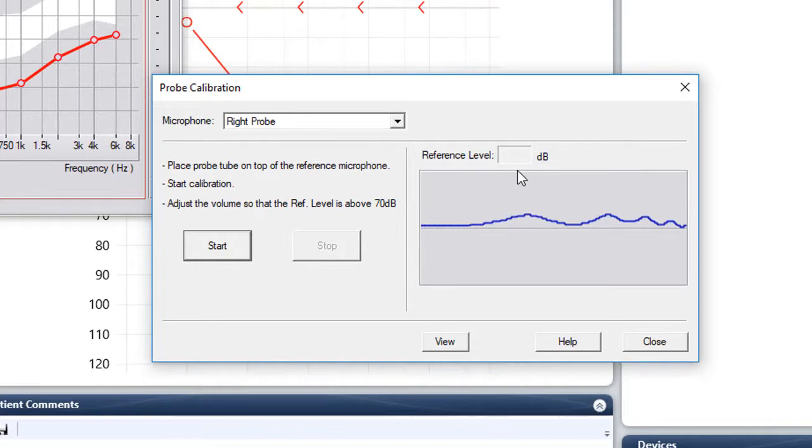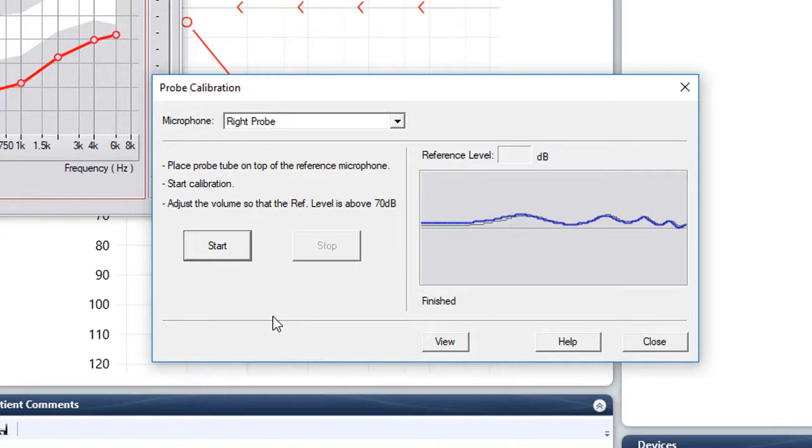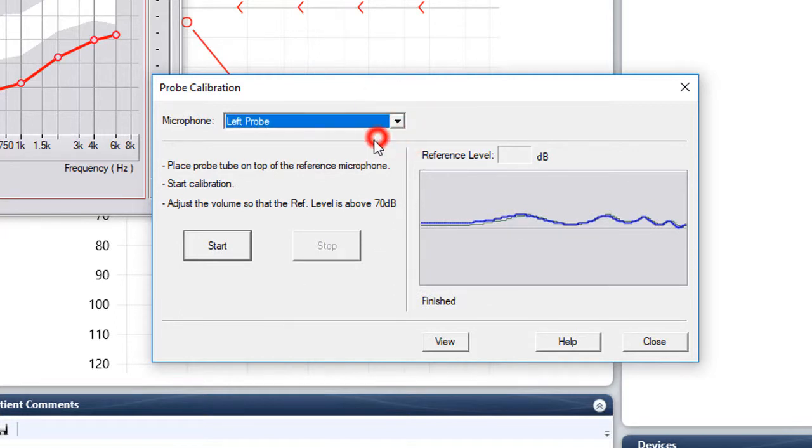This is very similar to the speaker calibration. All you have to do is hit the start button and it will stop automatically. That was the right probe so we'll drop down and do the left probe.